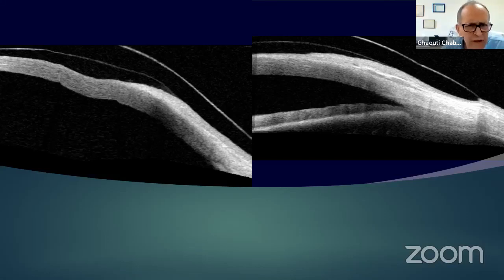I have a Heidelberg OCT, which also has an anterior segment model. So the thing is that we have to change every time to put the lens and so on. It's a bit tricky. I know that there is a company where we don't need to put the lens, to put the ocular on the other side of that.